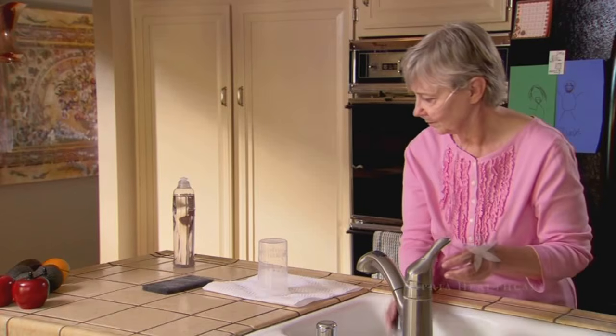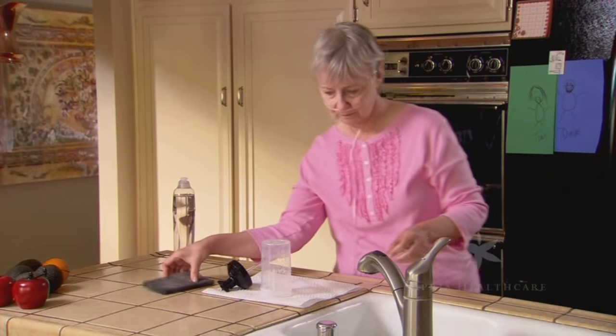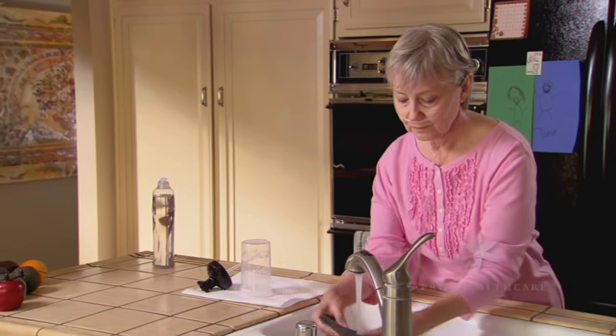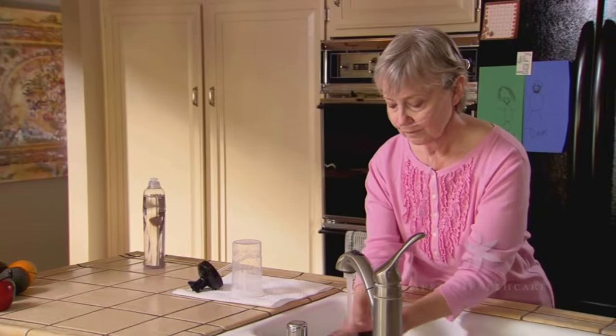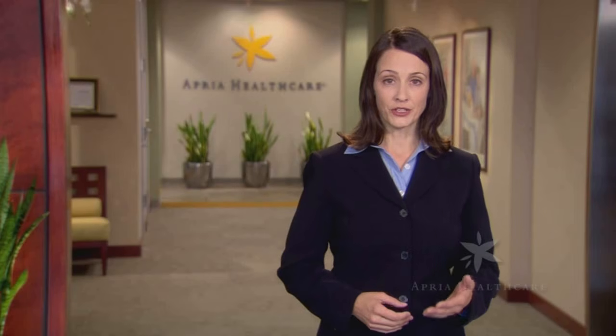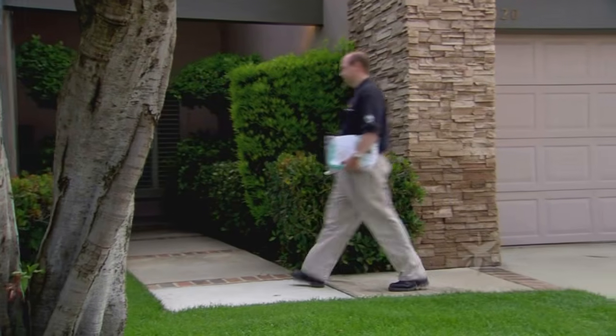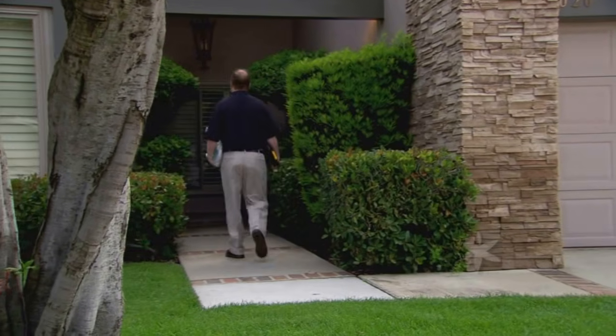Check to see if the filters are dirty. Remove them from the unit and wash them out with warm water. Then dry them with a paper towel and reattach. Filters should be cleaned weekly as noted in your patient instruction booklet. Your local branch can provide replacement filters if you need them.